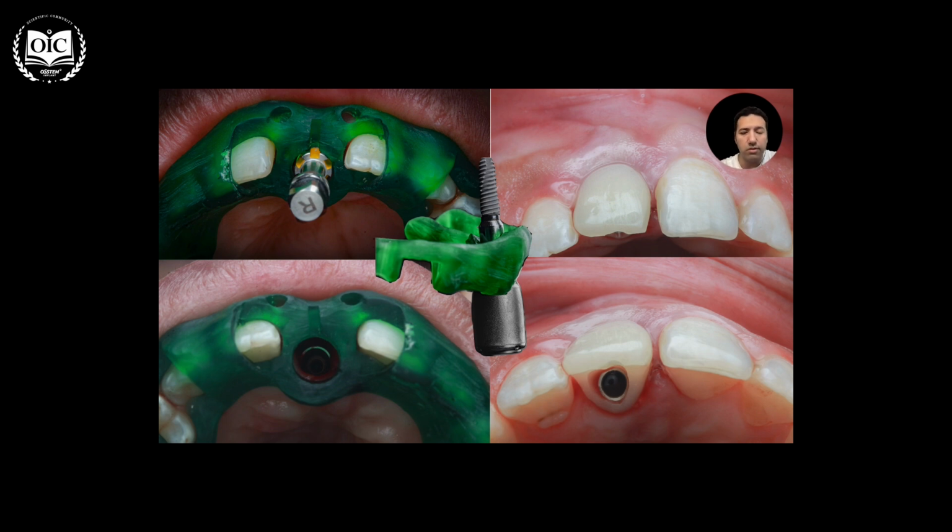of the soft tissue profile and not having to lose what you started with: soft tissue papilla position, the labial tissue thickness, and the emergence profile. When you have this combination preserved from the first day the patient comes into your office to the last day you deliver the final crown, you will not lose a single millimeter of this, with correct management and placement of a temporary restoration on the same day.